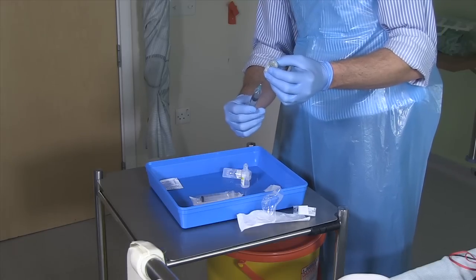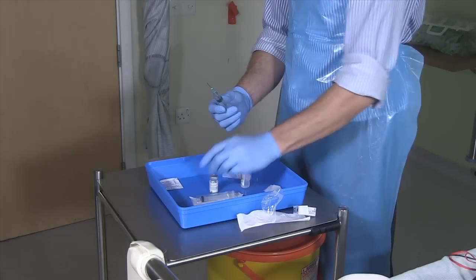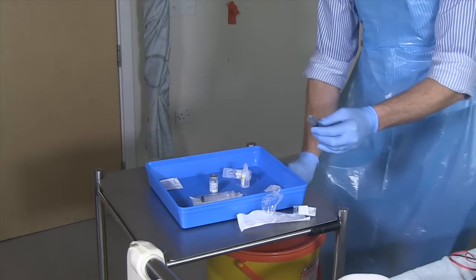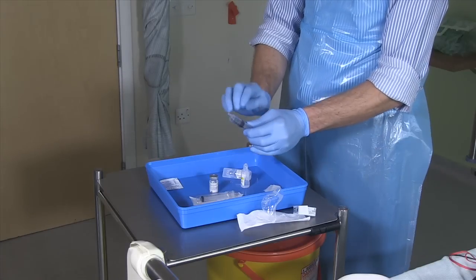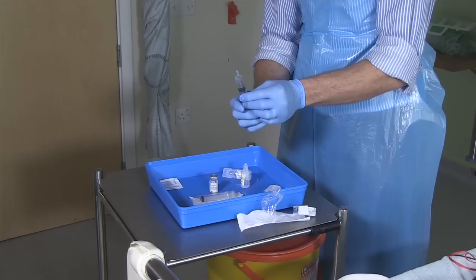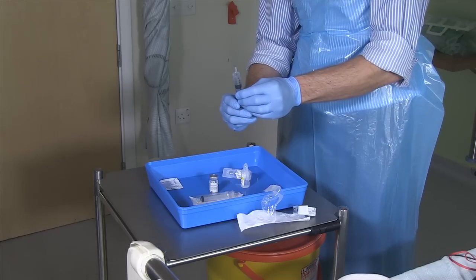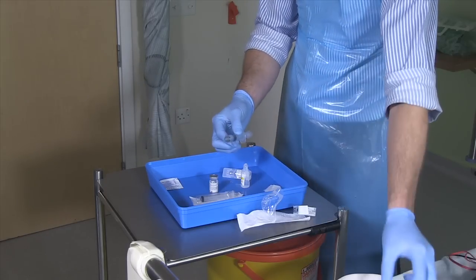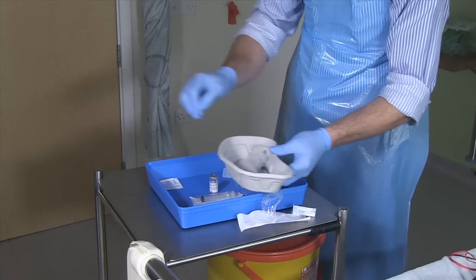You can now remove the used needle and throw it into the sharps bin. If necessary, replace it with a new one. Remove any air bubbles by gently tapping the syringe barrel and check that you have the correct volume in the syringe. Put the injection with the needle, if it's there, into a kidney dish for administration to the patient.